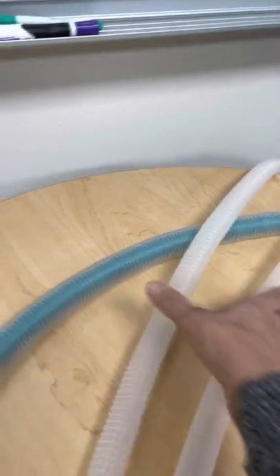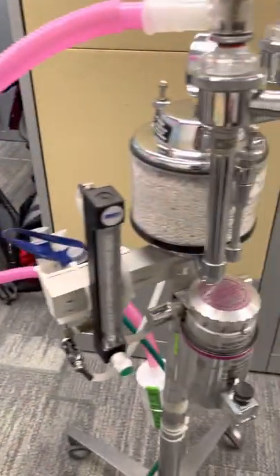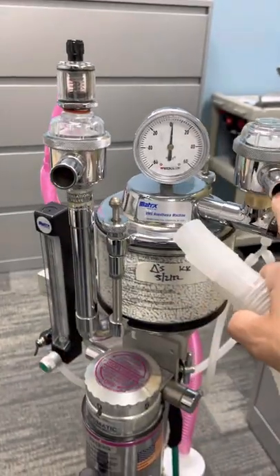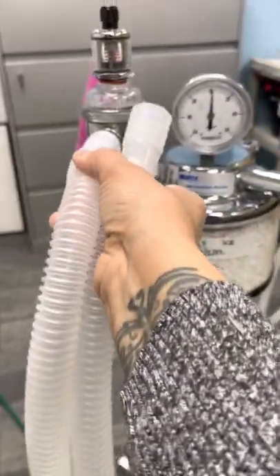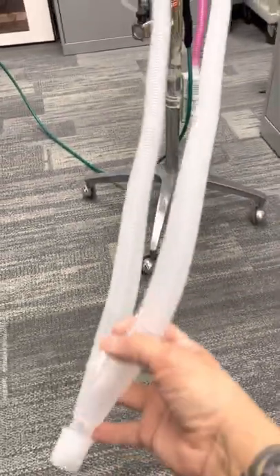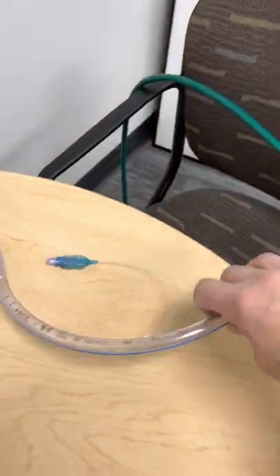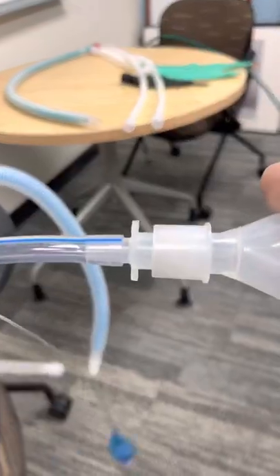All right, so I'm going to just grab the larger diameter Y tubing, and I'm going to connect it to my machine. This is the inspiratory inlet, and then here's our expiratory. So breathing in, breathing out. So we just basically attach those to the machine. Okay, remember, this is going to be that circle where they actually rebreathe. Okay, you can see I can come all the way down to my Y piece here. That actually is what would be connected to the endotracheal tube. So I'm just gonna add that on the bottom here so we can see the full circuit. So I've attached it. We're just gonna set that off to the side.